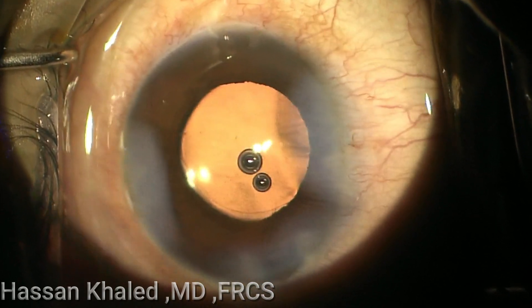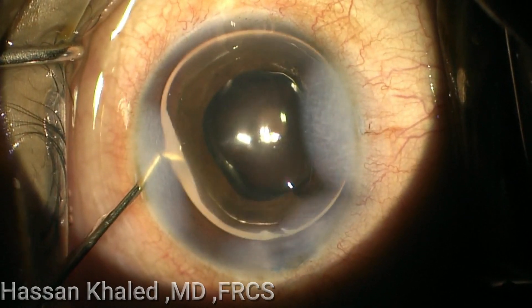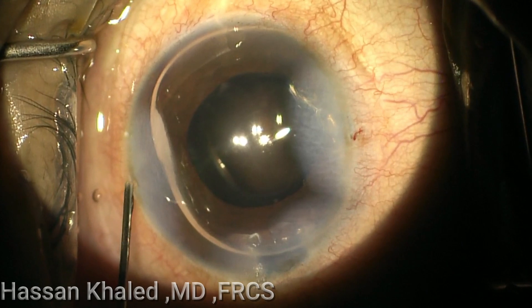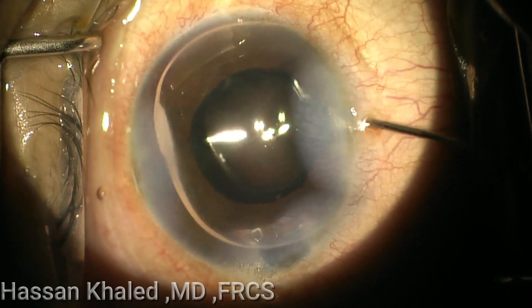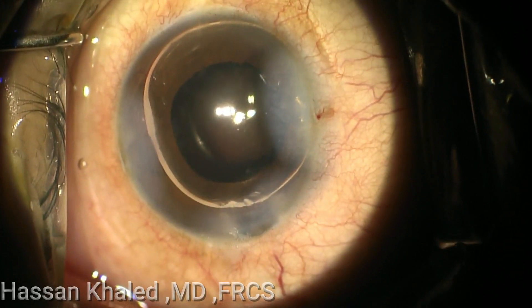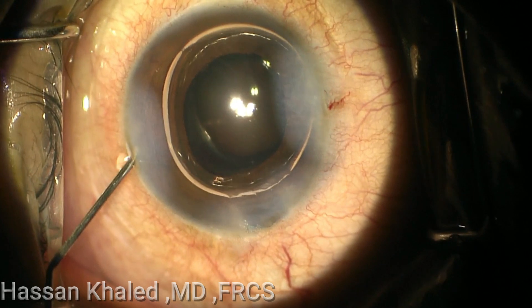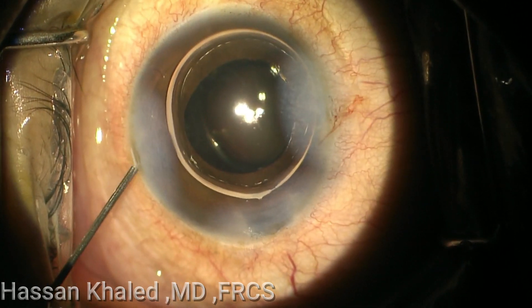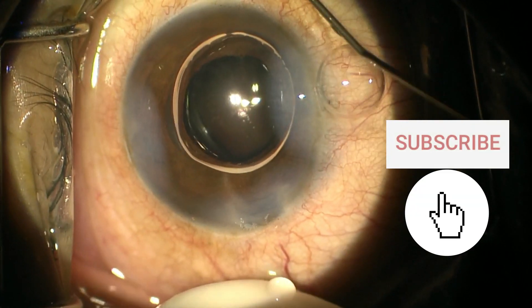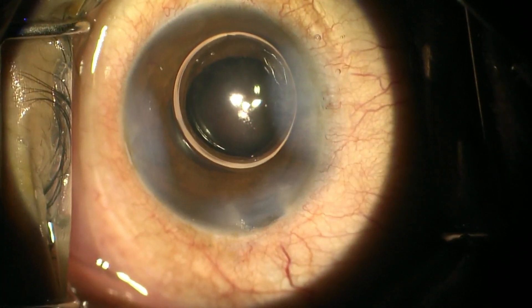I see that the bleeding has stopped. Then I inject an air bubble inside the anterior chamber in order to elevate the eye pressure. Some surgeons advise injecting diluted adrenaline. Now you can see the bleeding is stopped. I leave this air bubble inside the anterior chamber, modifying the IOP by the end of the surgery and ensuring there is no leak. You can see the bleeding is stopped, and I test for leaks through the paracentesis and the main incision.